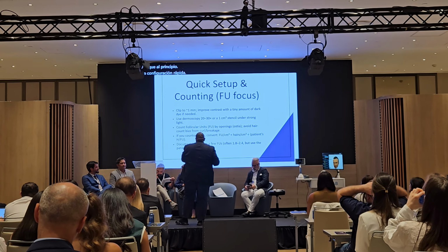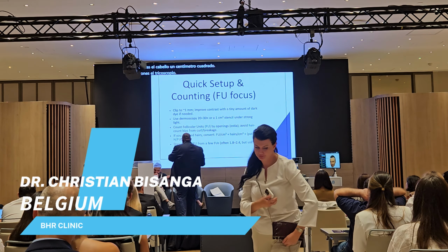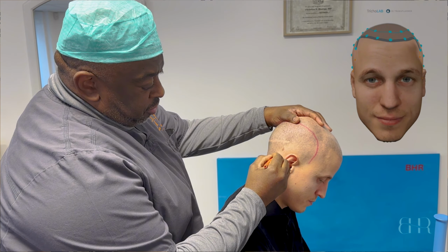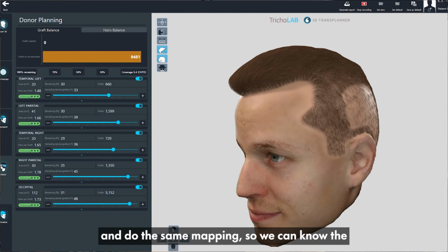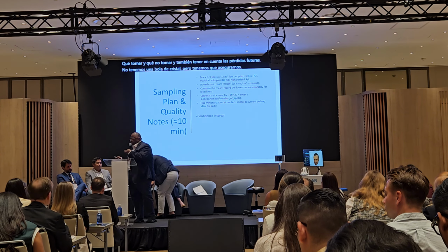But you need to estimate the safe donor. I used to estimate the safe donor with a 2D, but then I moved to a 3D because the 3D gives me the ability to have more understanding and more accurate measurement in assessing what we do.